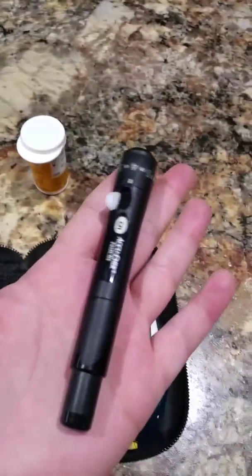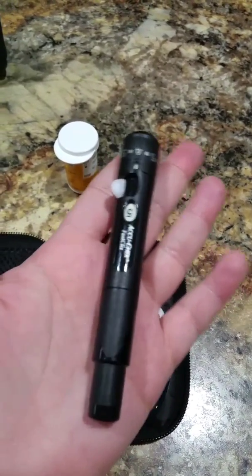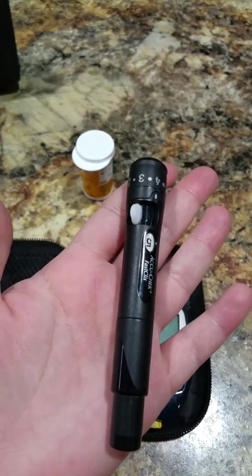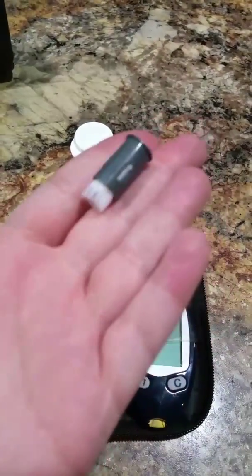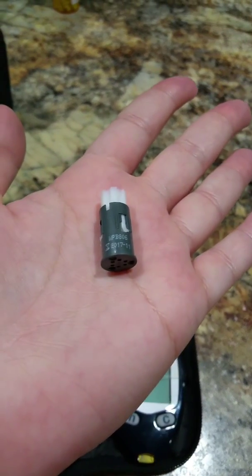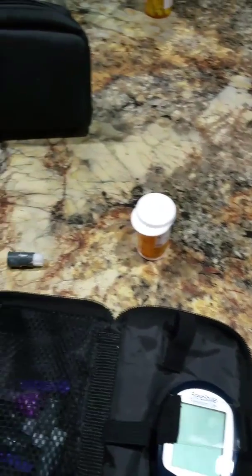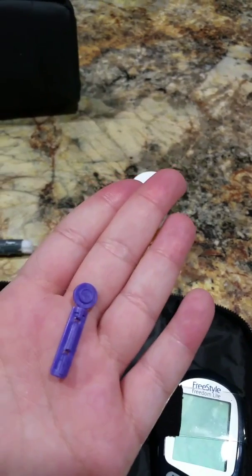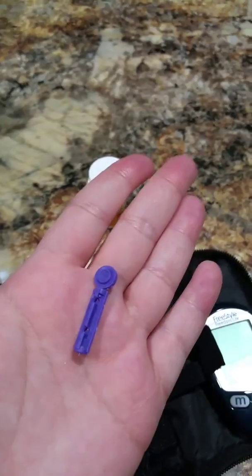You're going to have one of these that holds your needles for pricking your finger. It's either going to look like this or maybe it's a little bit smaller. If it looks like this, then you'll have these things, which are called drums, and they hold the needles that prick your finger. If you have a different kind, you might use these things, which are called lancets. They also prick your finger, but I don't like these as much, but that's what they're for.